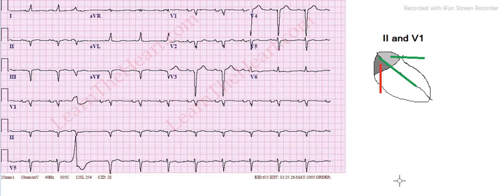And when we recall the different types of leads, you can find that this is lead 1, this is lead 2 and this is lead 3. So you see here that lead 2 is in the same direction as the resultant atrial depolarization vector. So the resultant atrial depolarization will be most easily and more pronouncedly seen in lead 2. This is the basic funda behind it.